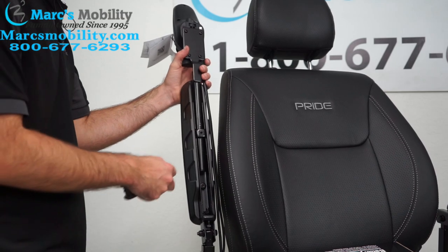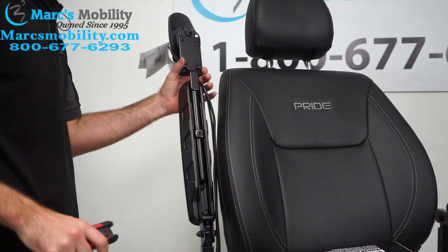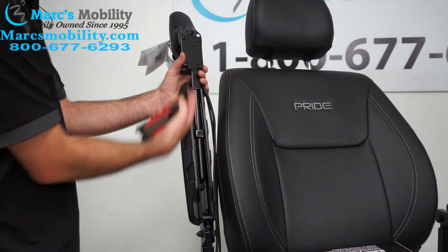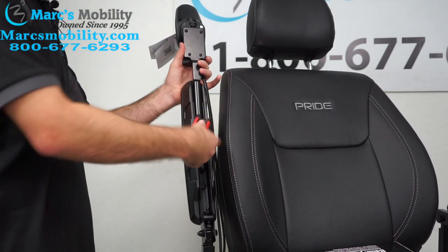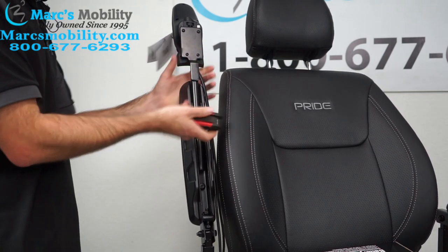With that loose, I can slide the arm forward or back. I've got zip ties on this now so it's not going to go any further than that, but you could extend it pretty far forward. When you're done — say I want it there — just tighten it again, and then re-zip tie any wires that you cut.